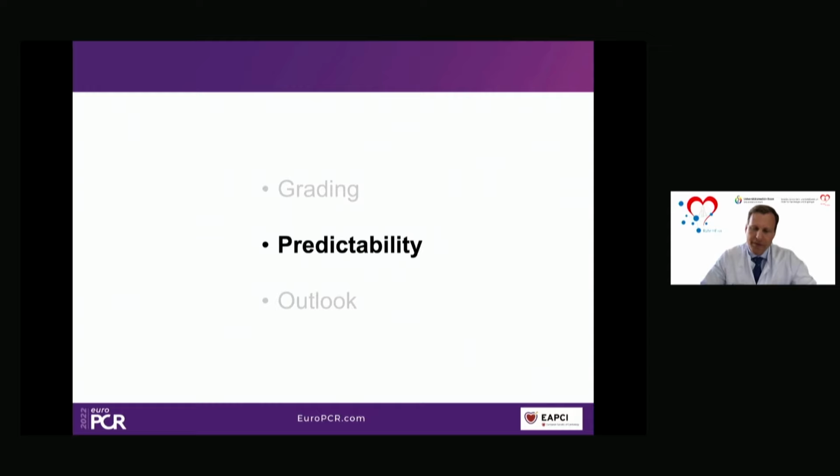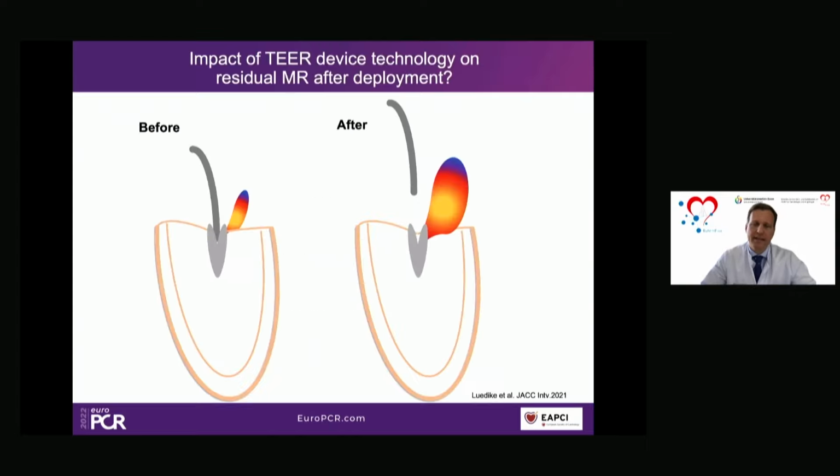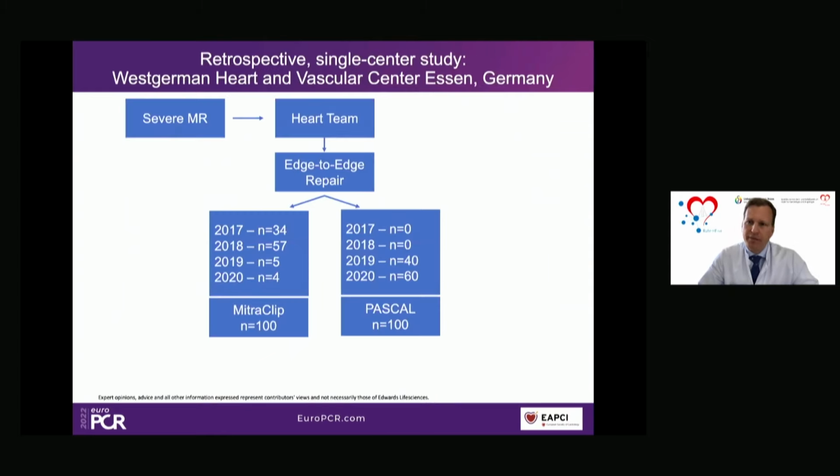Well, as you mentioned, we investigated the role of different mitral valve repair technologies on the predictability of the final result. And the motivation for this investigation was the fact that after the launch of the Pascal in Europe, a lot of operators reported after the first implants that they are missing this. In the meantime, we call it the moment of truth. What we were used to from the MitraClip era, that before and after releasing the MitraClip from the steering catheter, we often saw that the residual MR changed, deteriorated, became more, or when there was no MR before, then a new jet came up. And we had the feeling that these events were less when using the Pascal, and we wanted to somehow quantify this feeling.